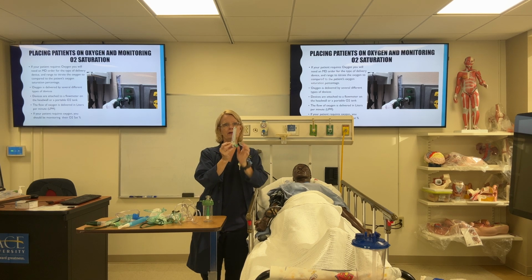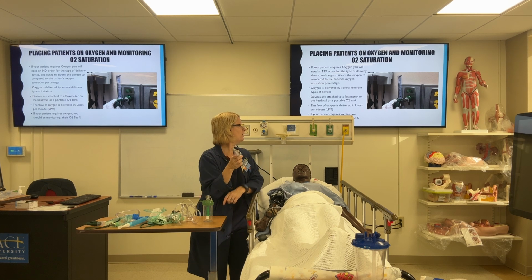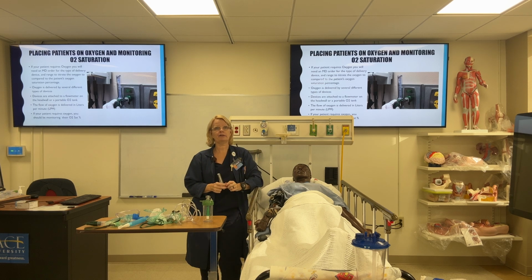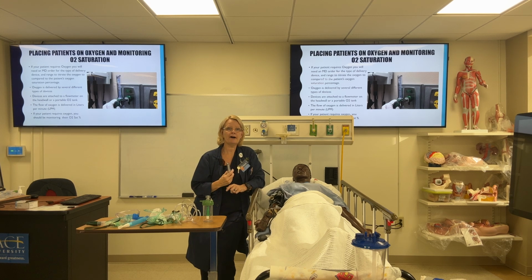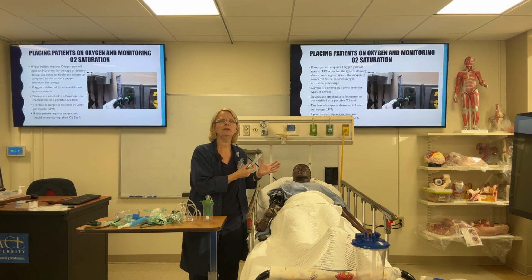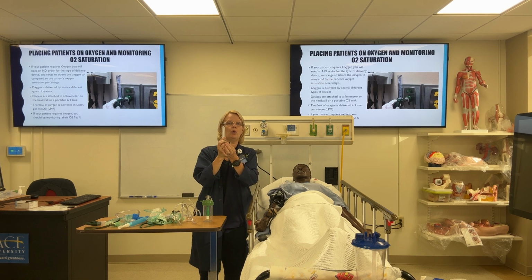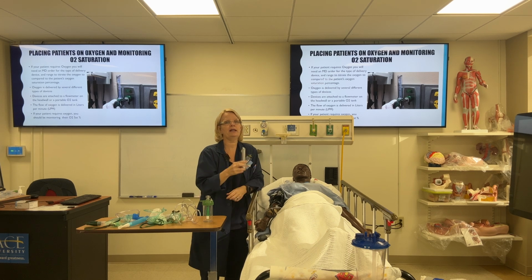The oxygen flow meter is always green in color. You're going to be plugging that flow meter into the head wall where it's green or marked oxygen. You're going to feel pressure when you're trying to connect the flow meter into the head wall, because remember, the oxygen behind it is under compression. So there's a little force needed to get the flow meter into the wall itself. Typically you see them already in the wall, but sometimes they're not, and you have to run and get one. These are what we call quick connect connections, so you push in and then screw it tight onto the wall.